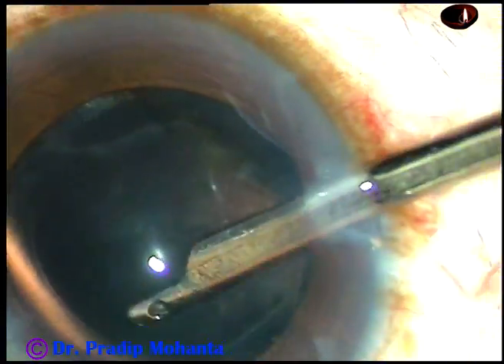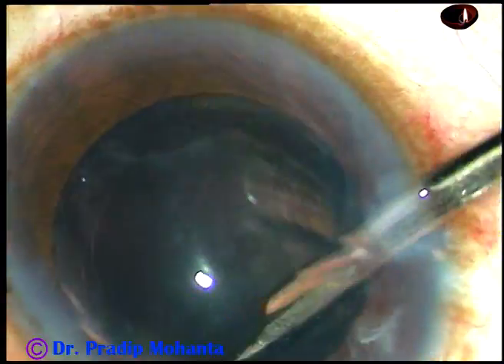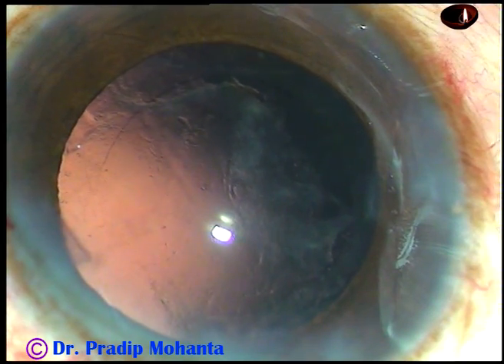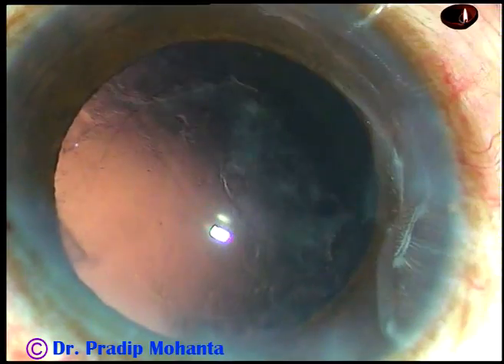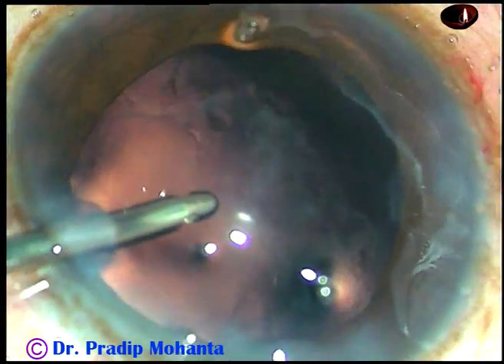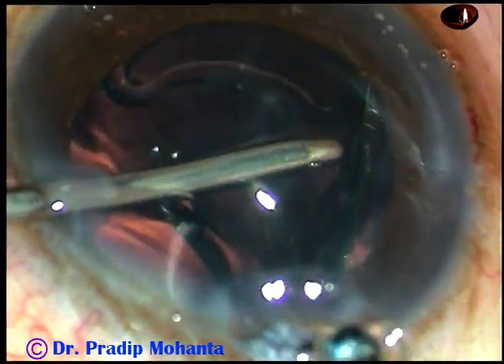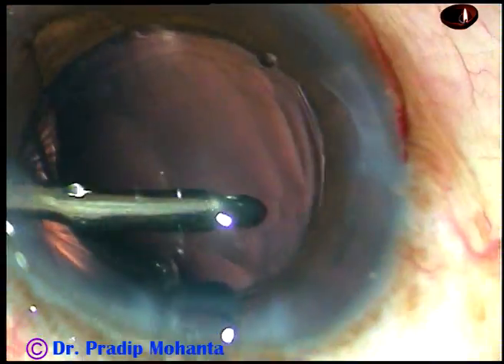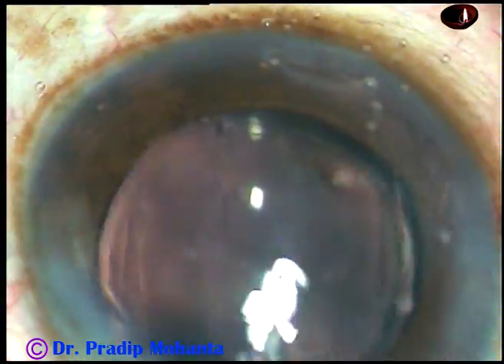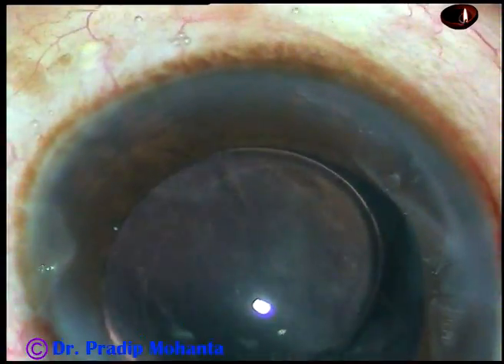And now the sub-incisional cortex is removed. The side ports are a little larger than what you need in bimanual, but still these side ports will close very nicely, and the astigmatism produced by the main incision will be neutralized to some extent by these slightly larger side ports. And this is hydroimplantation of a hydrophilic foldable intraocular lens. The leading haptic goes into the capsular bag and by a push of the left-hand instrument, the trailing haptic also goes into the capsular bag. You can see the rhexis is covering the optic all around, so the size of the rhexis was ideal in this case.